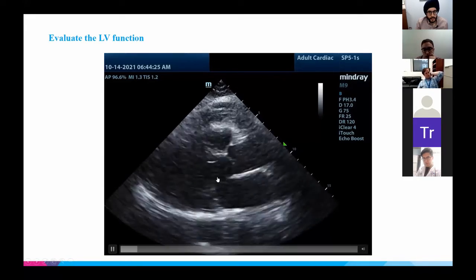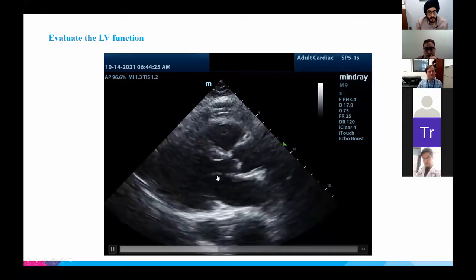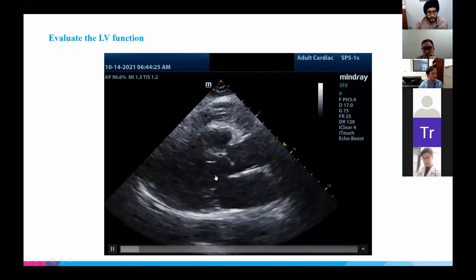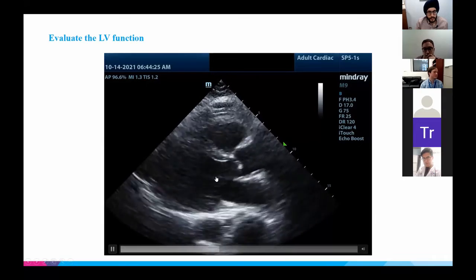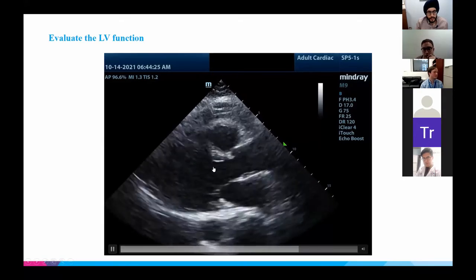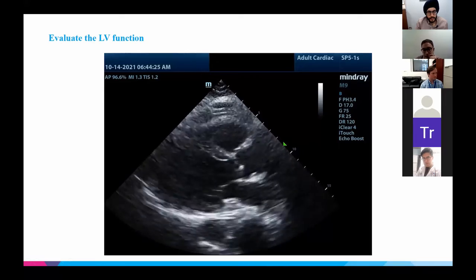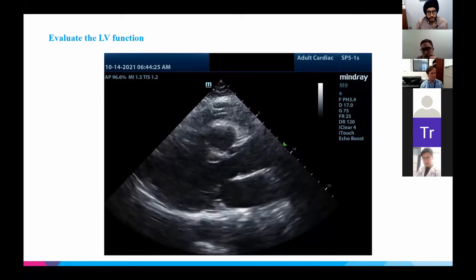So the main thing that you have to work with is the anterior leaflet of the mitral valve. And you want it to at least go past the midway point to delineate normal function. For me, it definitely goes past midway. It doesn't actually touch the septal wall, so it may not be to the point where it's hyperdynamic, but I would say it's at least normal.